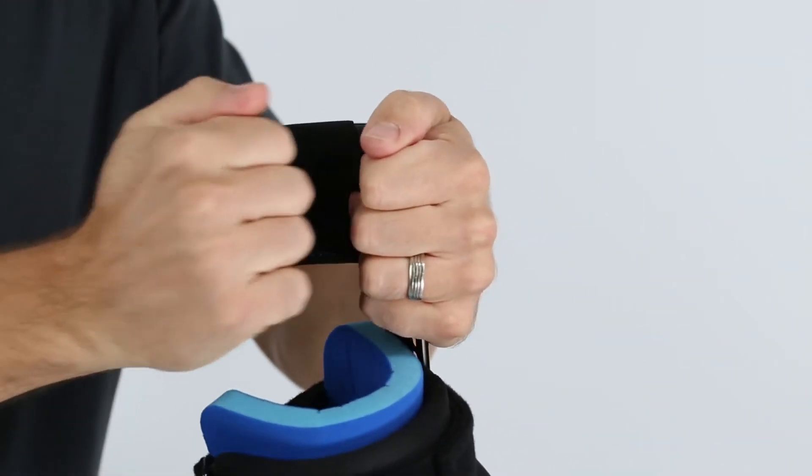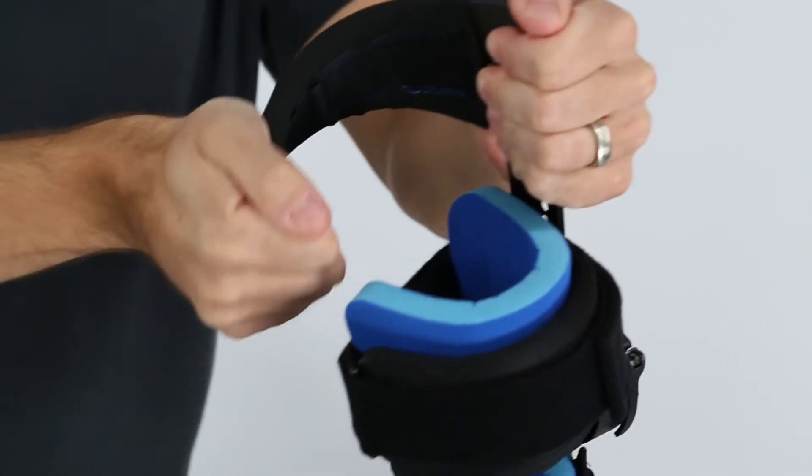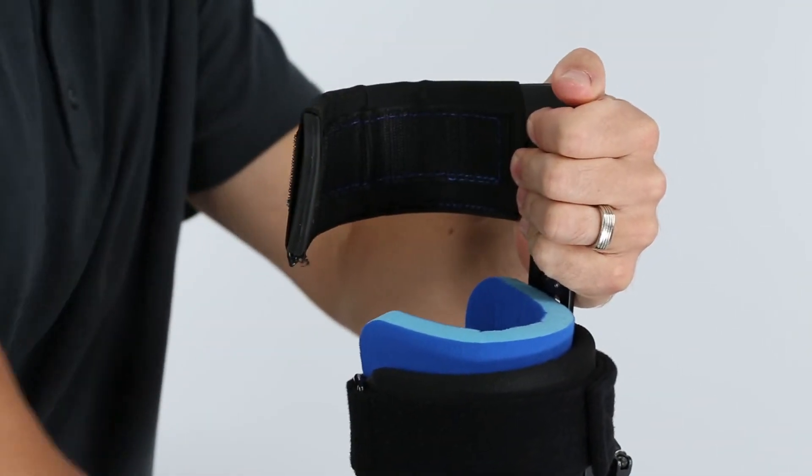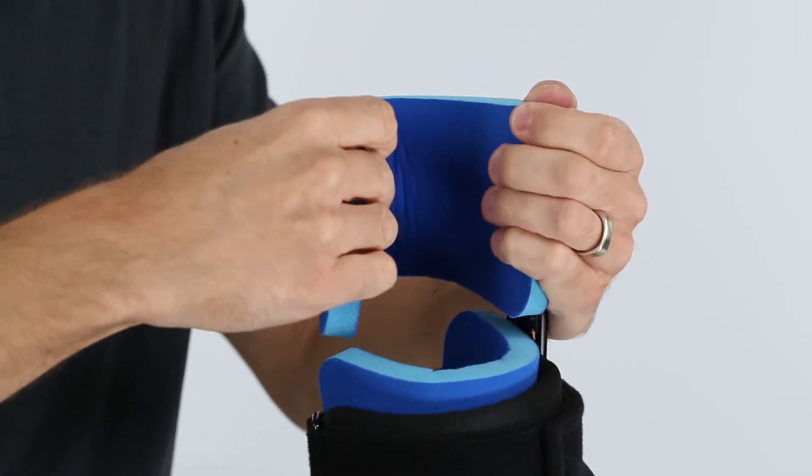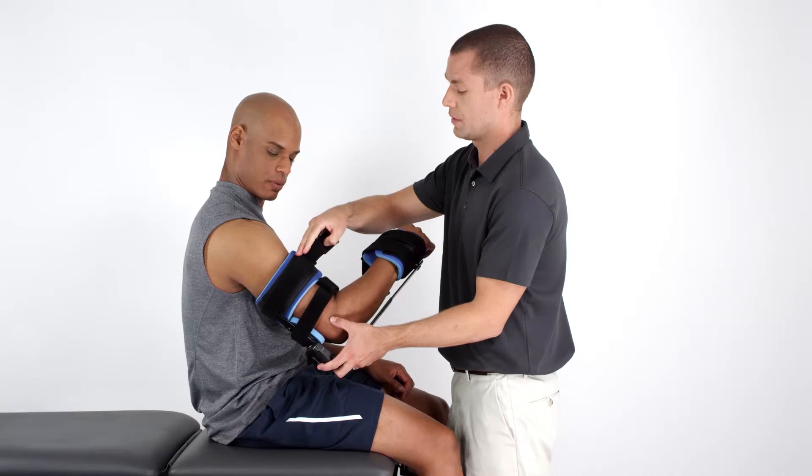The blue memory foam pads, which are attached to the cuffs by Velcro, may also be repositioned or even trimmed and sized to maximize fit and patient comfort.